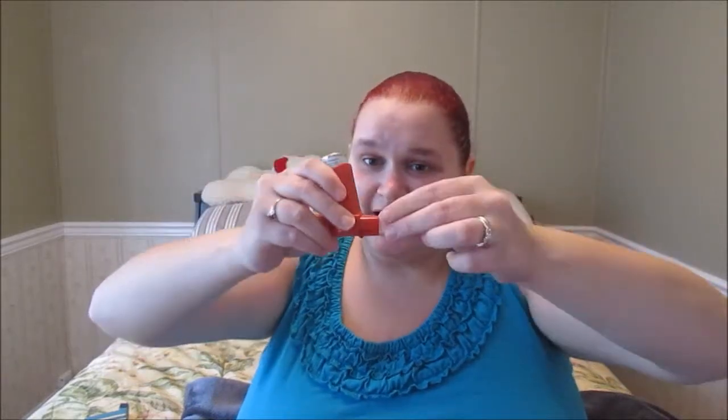Hold your breath for about 10 to 15 seconds after inhaling — it can make you a little dizzy. That holding is just to make sure it all gets absorbed. When you're done, take your puffer out, put the cap back on, and set it aside.